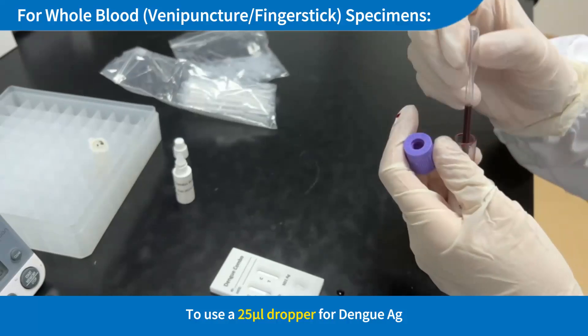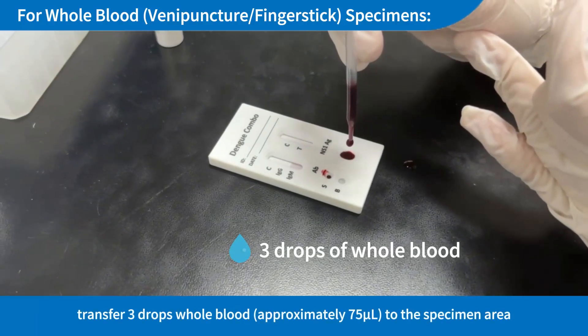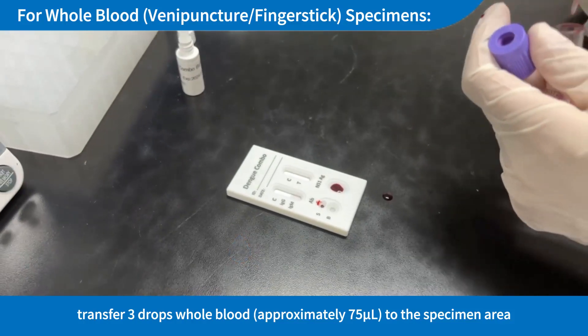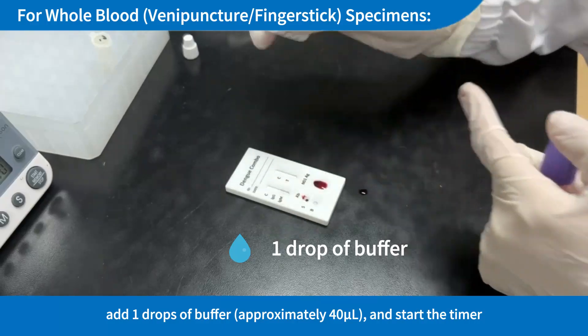To use a 25µL dropper for Dengue AG: Hold the dropper vertically and transfer 3 drops of whole blood (approximately 75µL) to the specimen area, then add 1 drop of buffer (approximately 40µL), and start the timer.